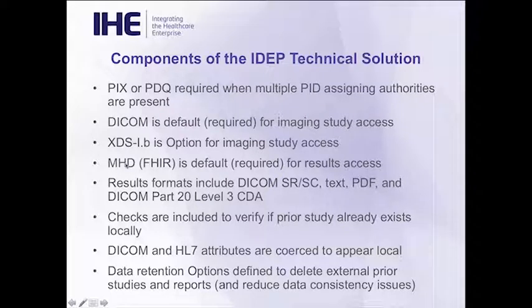There is no query in HL7 version 2, which makes it difficult to use HL7 version 2, and many reports are not stored in DICOM format. And so we've decided to just take a jump and move to the FHIR standard because all the existing standards for the installed base are a little more difficult to use. That does not mean that we won't be able to convert the results locally to be an HL7 ORU, for example.